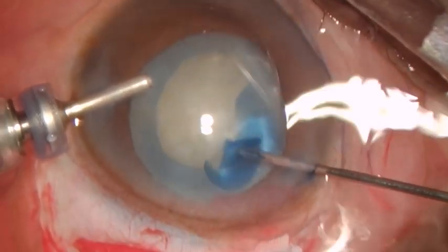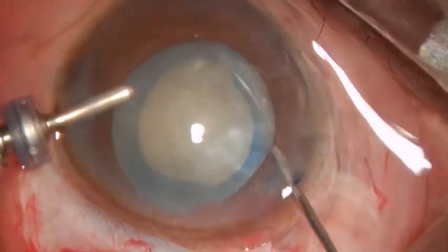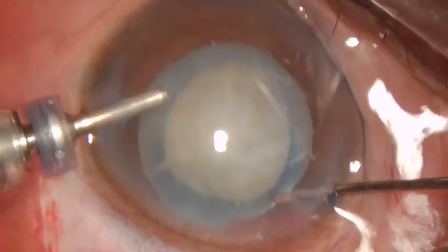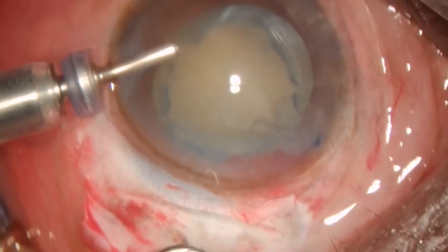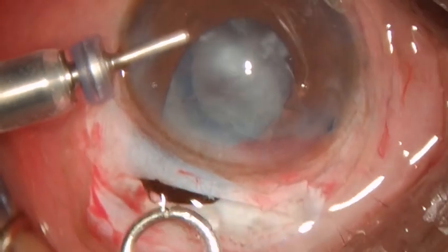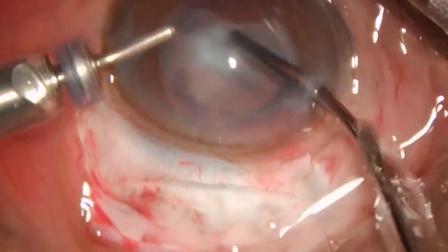In this 10th case, as the nucleus was large, a relaxing incision was given to the CCC as the CCC was relatively small. In all SICS cases, we would not have thought of doing surgery without visco, but we could do it easily. In different grades of cataract, we have demonstrated relevant steps and surgery in phaco and SICS.